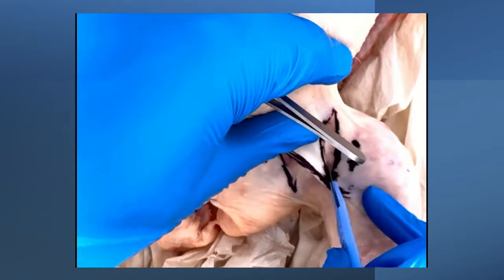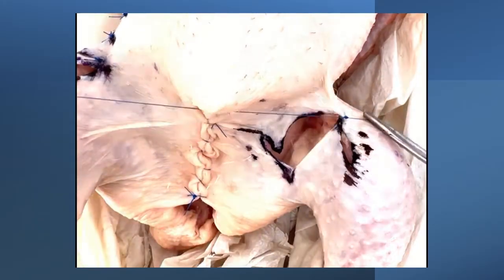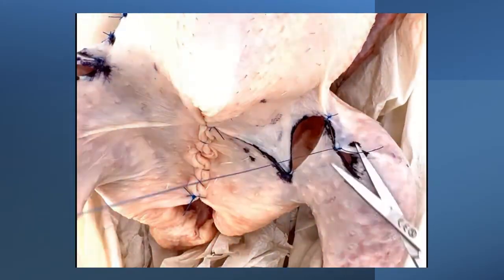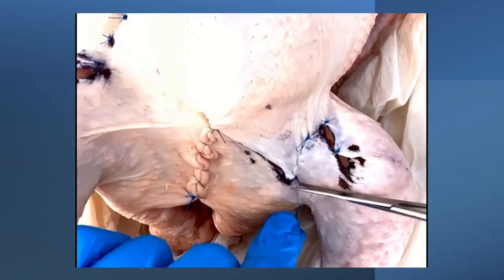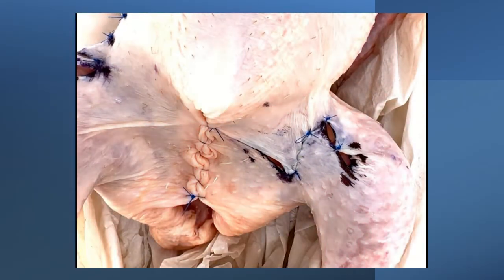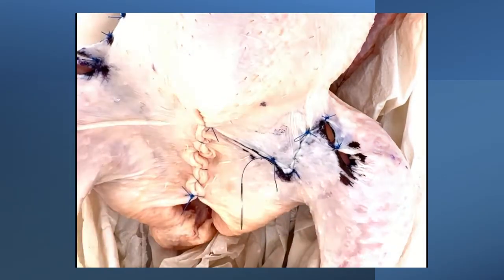And as before, we transpose the flaps across and stitch them in. And we can see quite clearly here the scar has been reorientated perpendicular to what it was before, and you don't have tissue now tenting across that groin crease anymore.